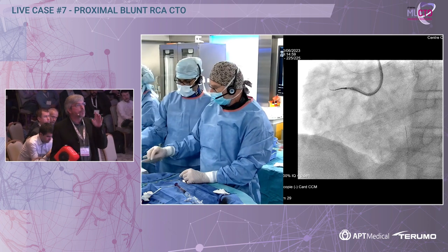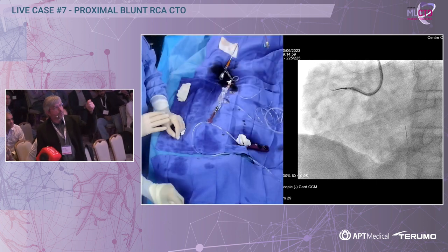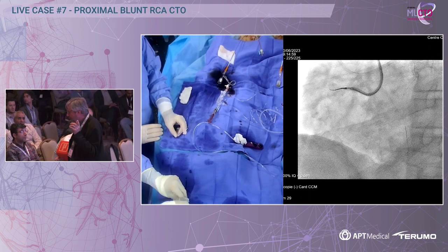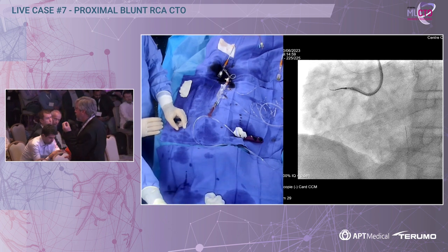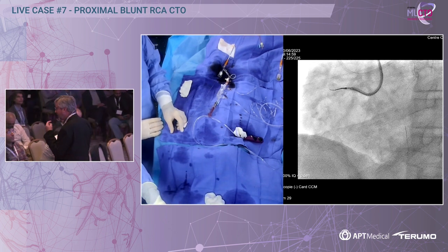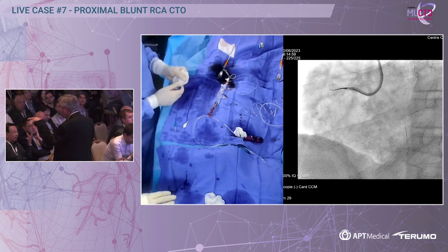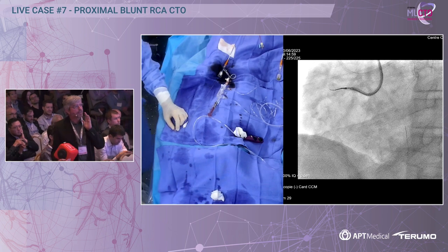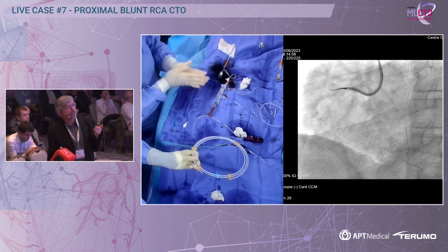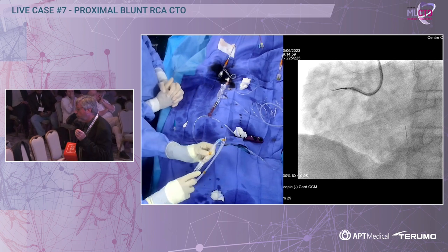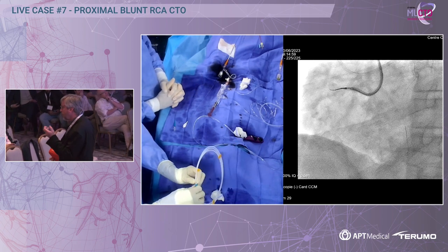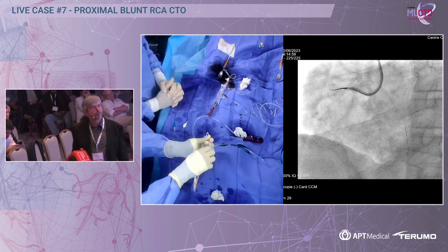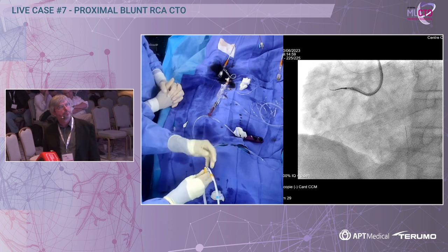I have to ask you something — watching you work this wire, I have the feeling it's not as controllable as it should be. We still have the basic decision: trust a knuckle or try to palpate with a wire, which in this case is not so easy. And another question: you are going femoral — what is the reason not to go 8 French, to have more options if it's difficult distally and if you want to use IVUS?